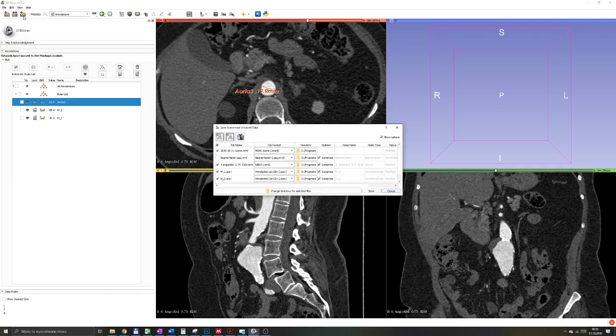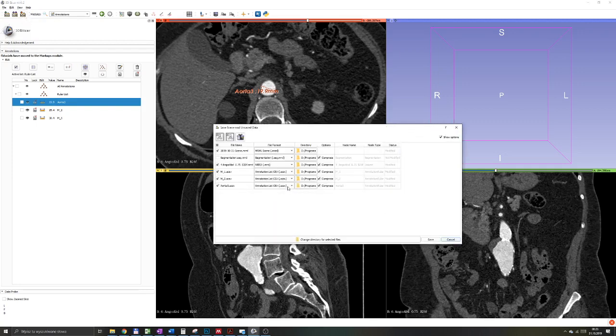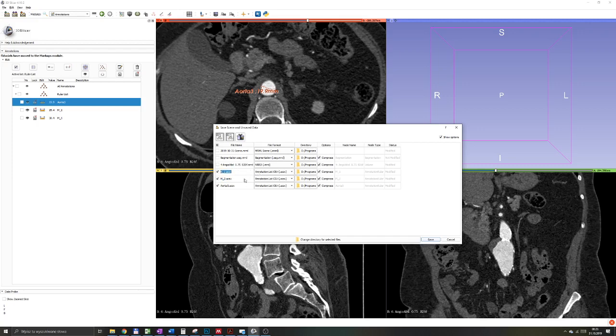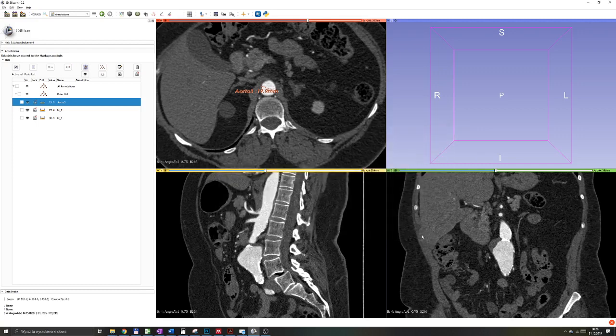you can open the menu, and you'll see that all your measurements are now saveable in this ACSV format. Please make sure you save them so you can keep track during your project of all the annotations you created.